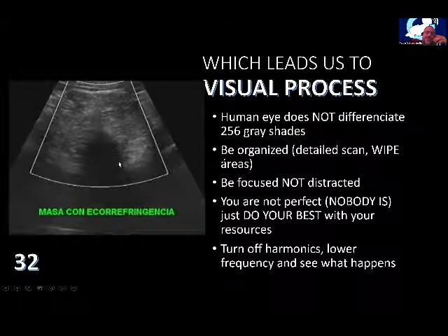Sometimes technology doesn't work. For some things, we have to use lower intensities, lower frequencies, turn off harmonics, and see how it looks. Make your own system and choose the system that works, and audit yourself, examine your own performance, and whenever you can, ask the surgeon what happened and what wasn't.